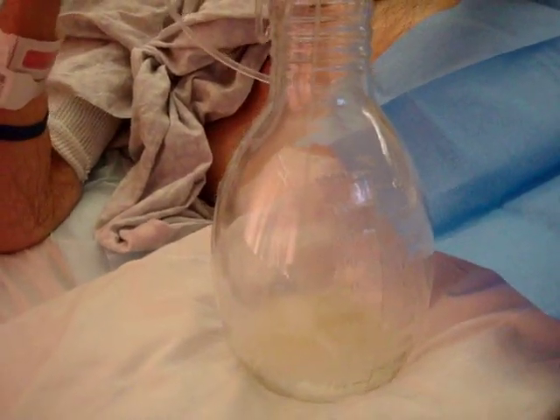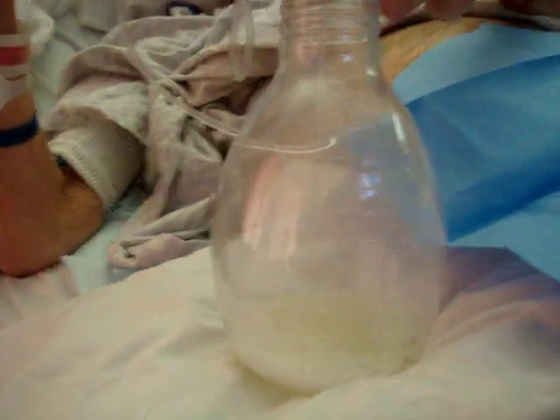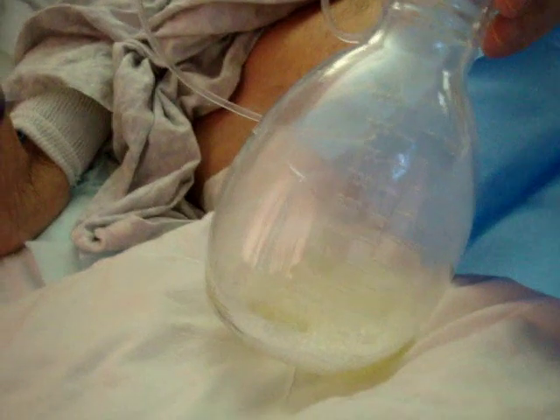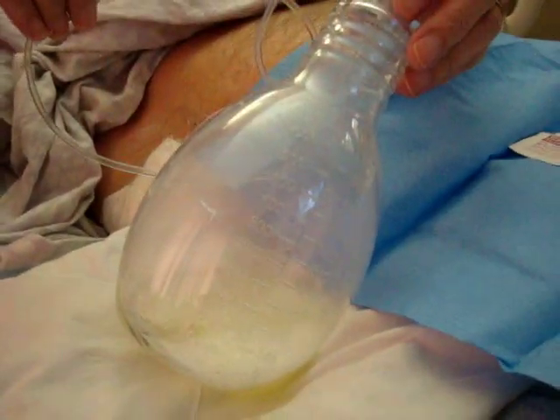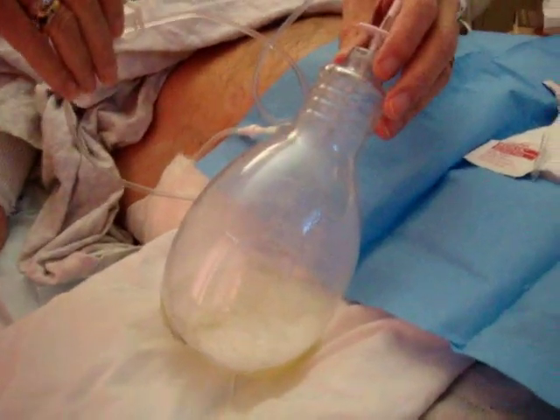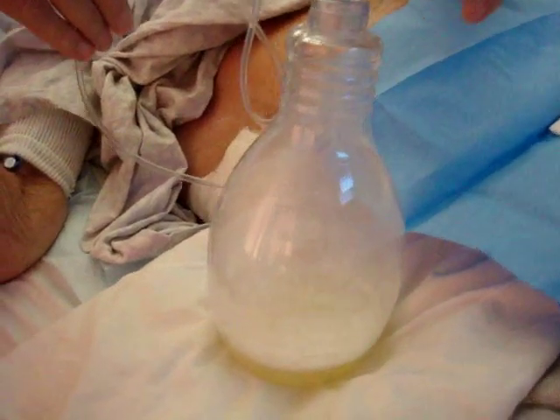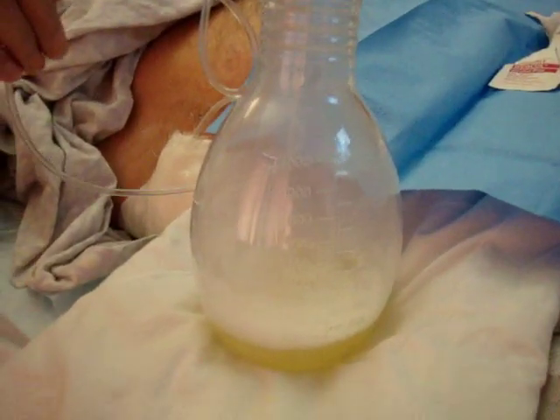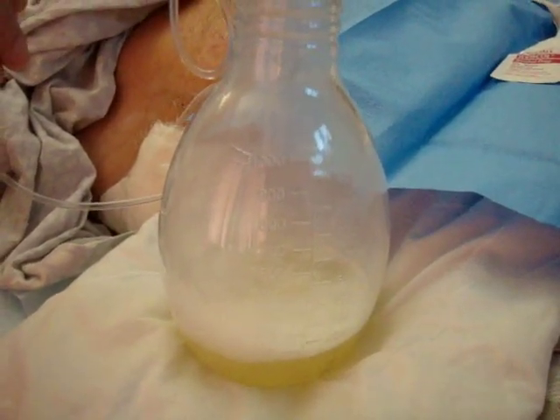You can control the flow by the clamp if it's going too quickly. You can get a little bit of cramping and pain — I did have some the last time I did this. But it seems to be alright so far. You can see a steady stream of the colour it's been before, so that's a good thing.